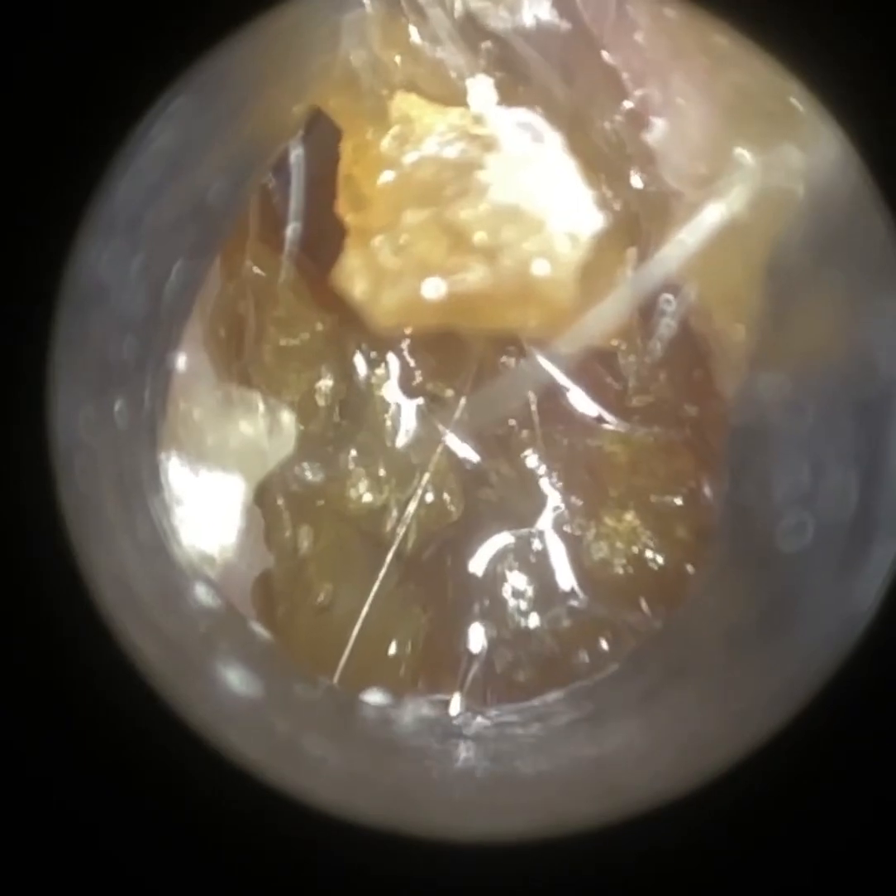It's a bit difficult sometimes to get a suction grip when it's really dry, so olive oil spray can help. It just helps to soften the surface of the wax and skin a little bit. Because I wasn't getting a good suction grip there initially, the sucker was actually pushing it a bit further in. So you have to be careful when it's really dry and coarse wax like this because you can inadvertently push it further in. So I just put a squirt of oil in here — that's just changed the consistency and it's going to help me get a suction grip.